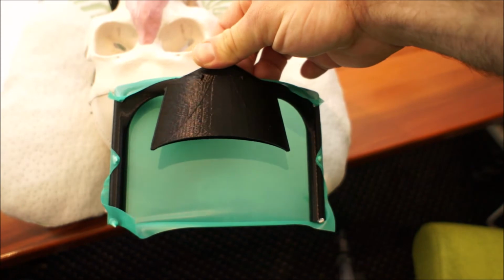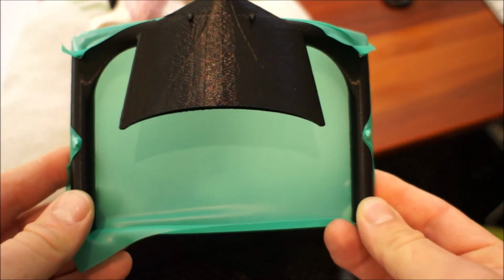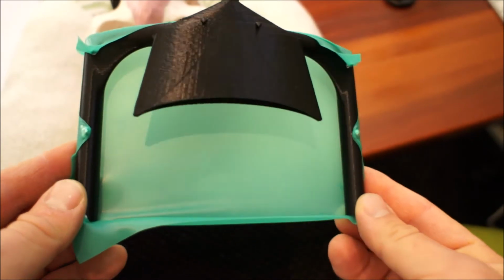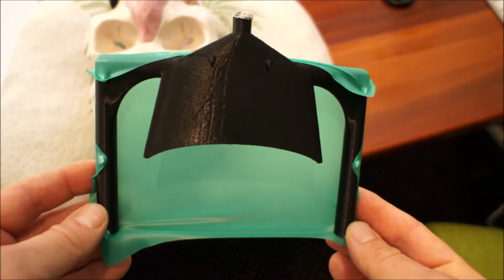The second thing I need to mention is that I will follow up this video with a more beginner's introduction to rubber dam fitment, so that people who haven't been using rubber dam for very long also have something to go from. So this is the penultimate prototype fitted to a green sheet that looks like it's actually covering half of the sheet, and you'd be right.